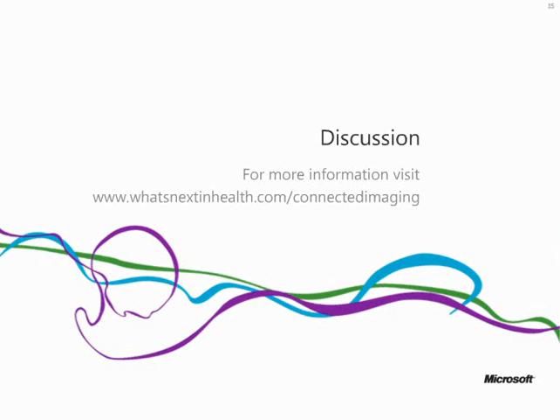So it does support a single sign-on context launch up to the study level information, patient and study level information. So you don't have to sign in again, you don't have to select the patient again, you don't have to select the type of study again. It understands the information from the PACS and launches it. So I hope I answered all those three questions.